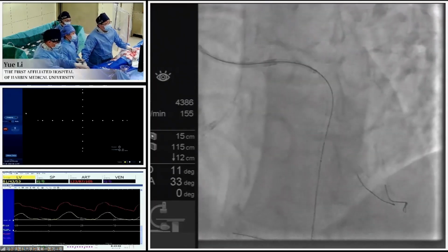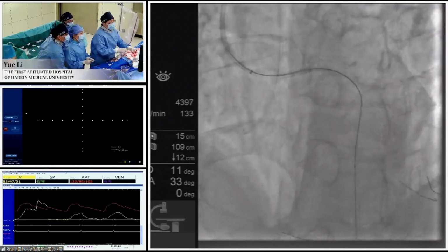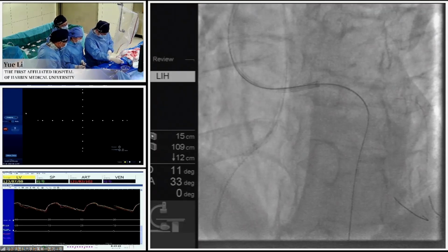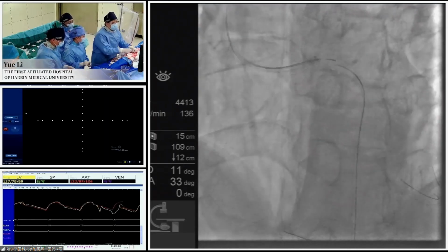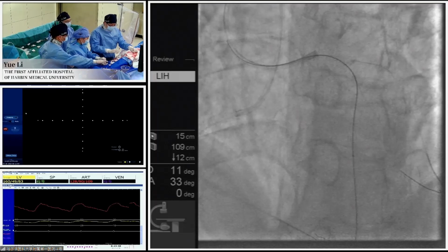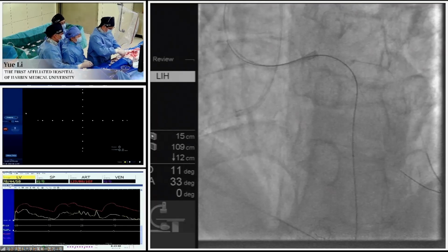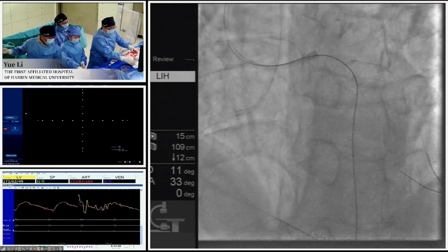Although this is not the first time Professor Lee has made the demonstration of the 3D CTA reconstruction, every time Professor Lee performs this, it strikes me a lot, because the 3D reconstruction offers a lot of very important information of the CTO segment. For this case, it told us about the occluded segment length and also, more importantly, the proximal cap position. And this software is interactive because you can rotate the image to check from different angles, check the detailed information. In our facility, under the leadership of Professor Lee, we make full use of CT angiography images to perform CT angio FFR and 3D CT reconstruction. And more importantly, we possess proprietary intellectual property rights of this domestic software.